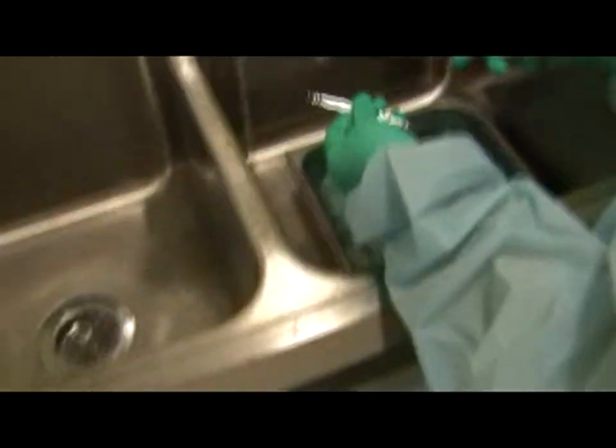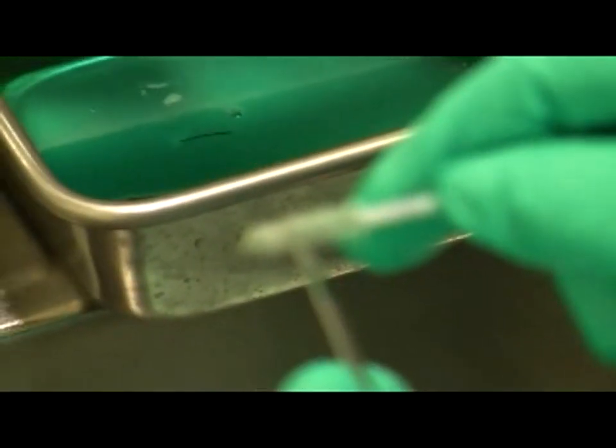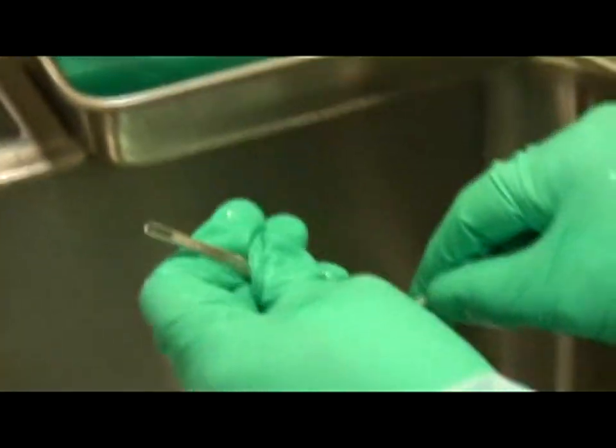The comodon extractor is cleaned the same way as the curette — go in with the small brush, and use the same idea for the narrow end.